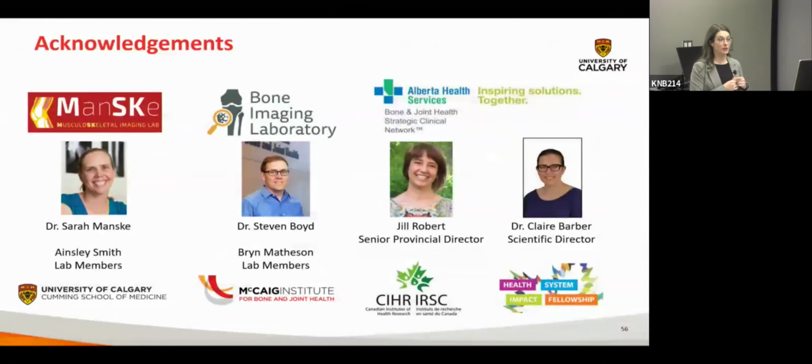Selfishly, I'm going to say contrast. In terms of the actual calibration, I think contrast has maybe one of the biggest effects, since if we're talking about internal calibration, absolutely, it's affecting the tissues we're using for the calibration. I also mentioned kernel reconstruction can have an effect on the calibration as well. I can't remember the other ones. Arguably, contrast in the context of internal calibration would have one of the larger effects.